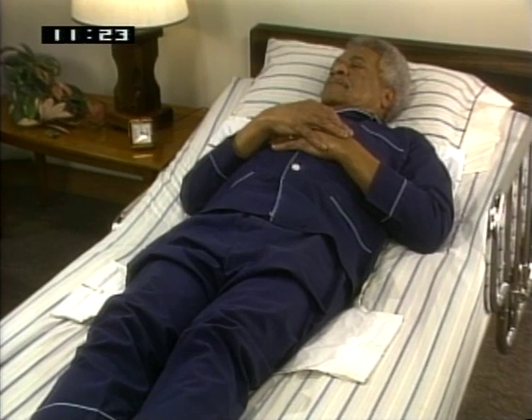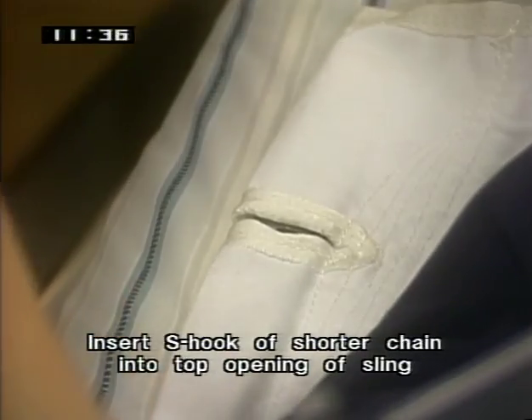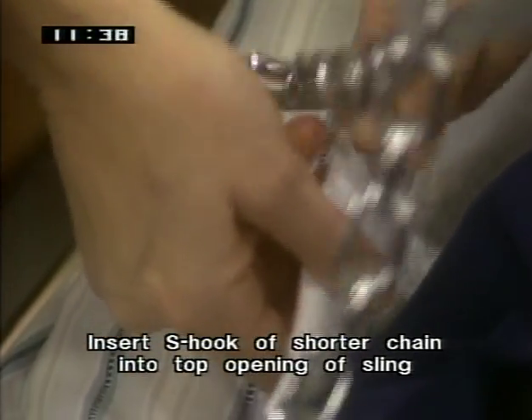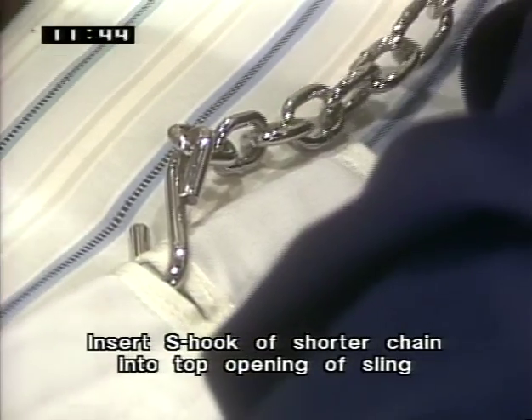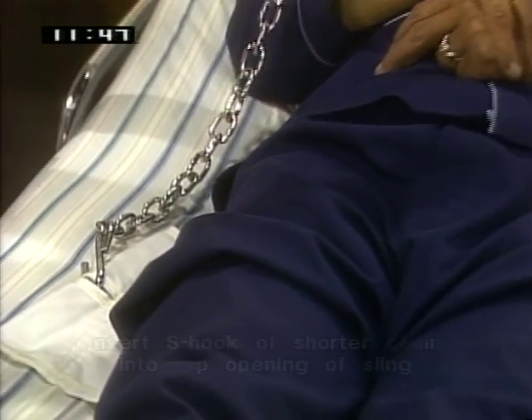It'll take some practice to get the position correct. The lower edge should reach to the patient's knees, the upper edge to the patient's shoulders. Attach the S-hooks of the chains into the openings on the sling. The open end of the S-hook should face away from the patient, to the outside of the sling, and go all the way through the opening.